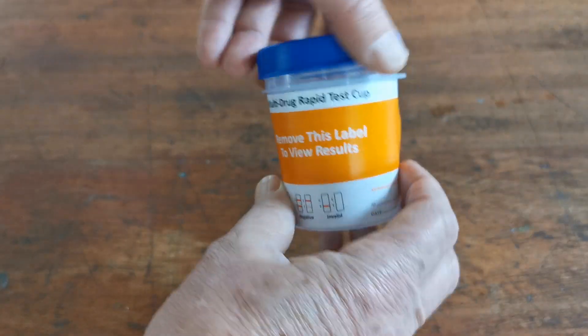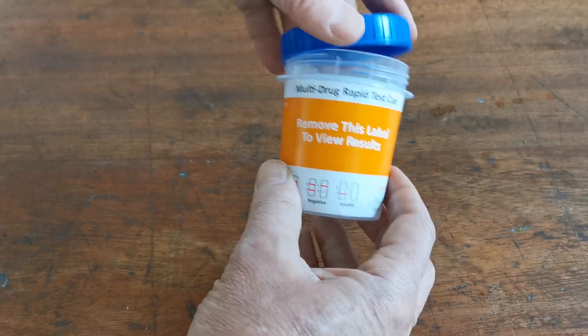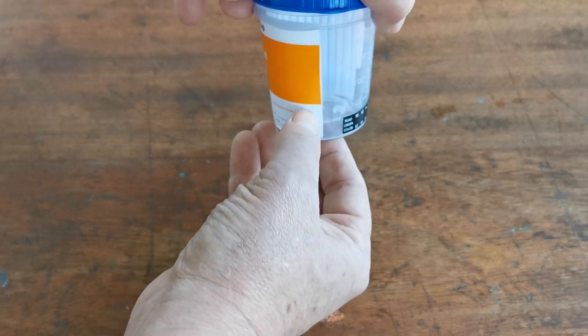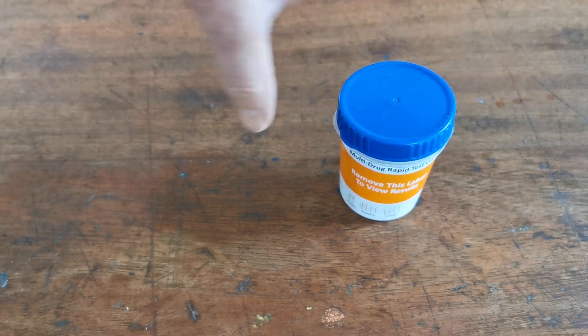The procedure is to give the cup with the lid to the donor, ask them to void a fresh urine sample into the cup, holding it upright to just above that minimum level. Let's go and put a test sample into this, and we'll show you the cup running in just one minute.